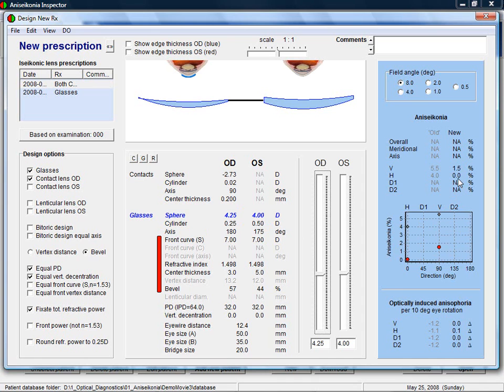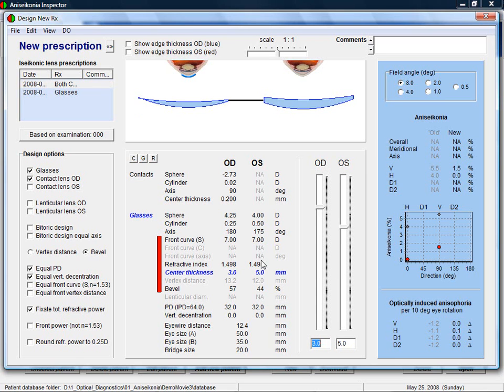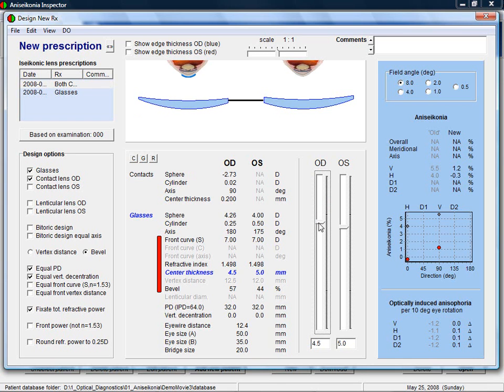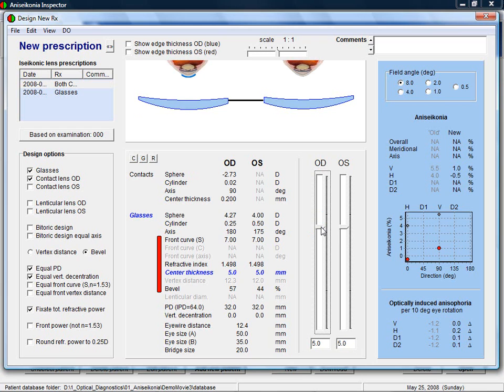The aniseikonia has now been reduced to near zero. But as you can see in the image, the edge thickness has become too small. Let's make that a little larger. The aniseikonia is now fully corrected, with hardly any aniseikonia left. In addition, there are only minor cosmetic implications.